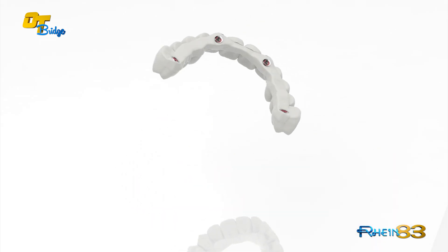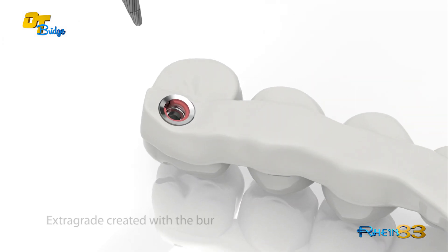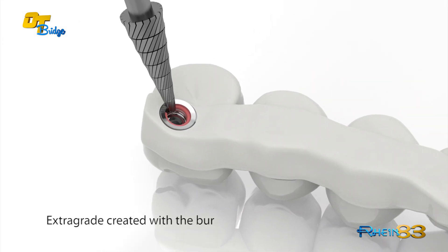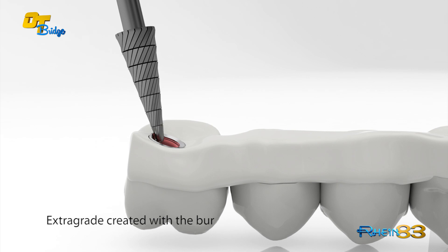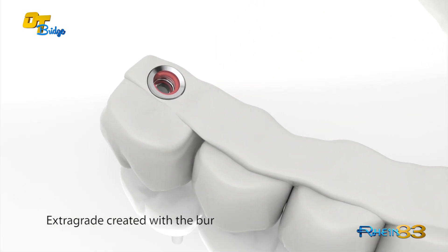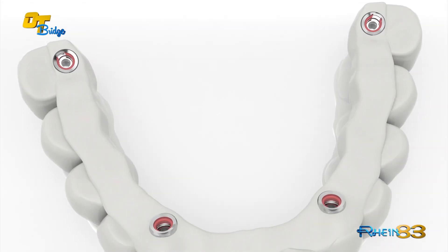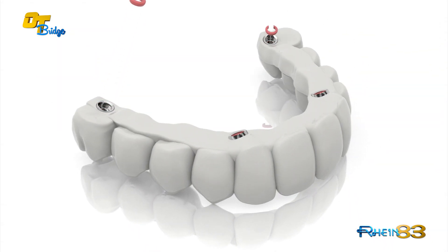In case of high divergencies, the technician creates manually the extra-grade flaring. This is done using a carbide burr to mill the base of the titanium abutments with lateral hole in correspondence of the maximum undercut created by the OT Equator abutments. This ensures a smooth insertion of the denture.